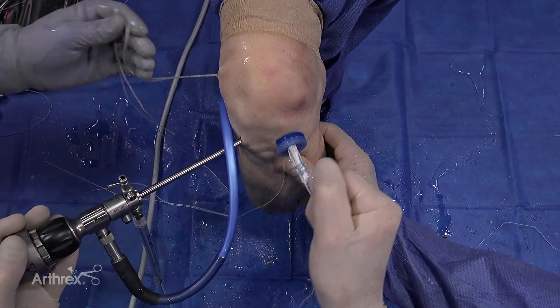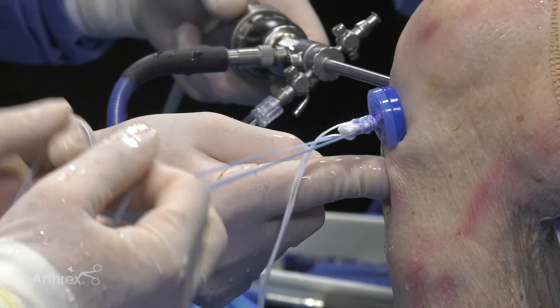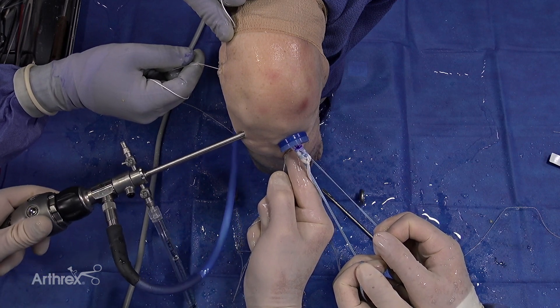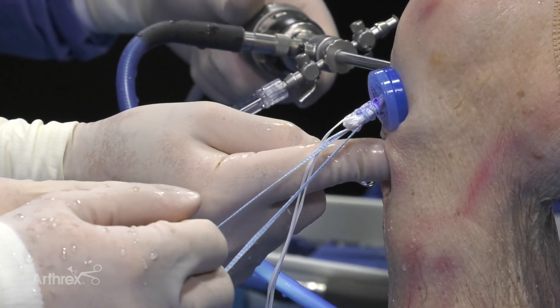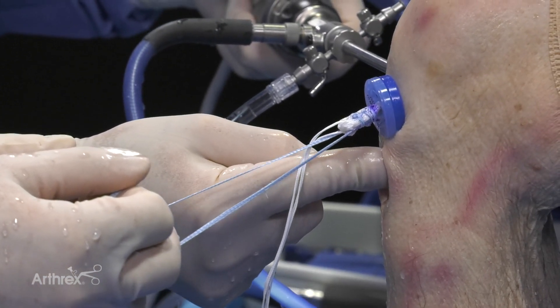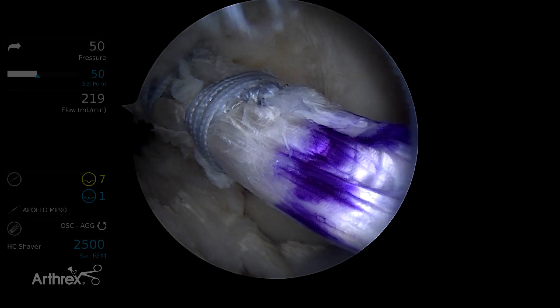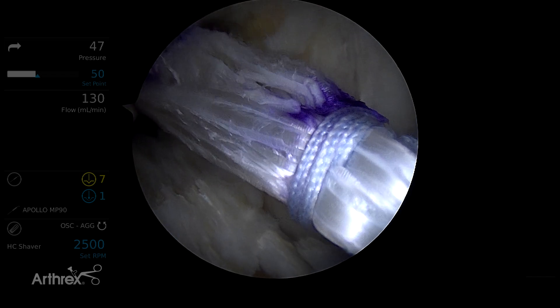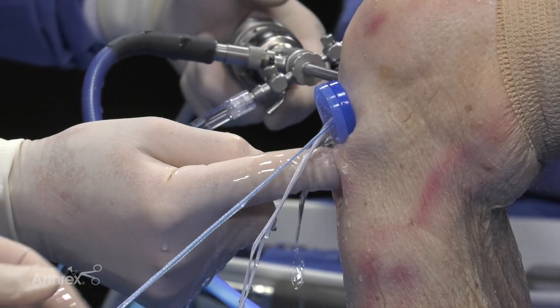We pull back and you can see our fixation. A key point here is I like to pull the slack out of the tapes. Now we're going to hoist the graft up into the femoral socket with the tightrope RT shortening strands on the femoral side. It's important to keep some degree of tension on the tapes so there's no slack of the independent internal brace. The graft was 63mm long, so we're going to pull it up 20mm into the femoral socket with our intra-articular measurement of 23. There's our graft going up into the femur to the blue line. Then we'll pass the tibial end of the graft with the no-button loop into the tibia and took the slack out of the tapes.